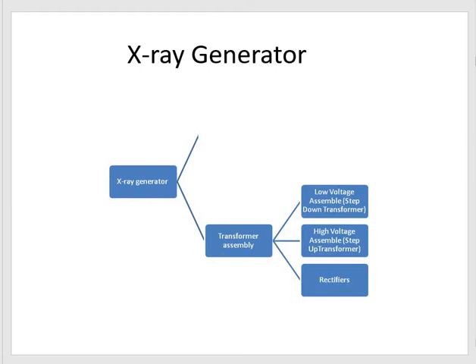In the first introduction, the introduction of the generator, we also had a brief look at the components that make up a transformer, and I did explain that a transformer is the component needed to manipulate the 240 volt power point supply to supply the circuitry of the X-ray tube and the circuitry in the filament, the X-ray filament circuit.